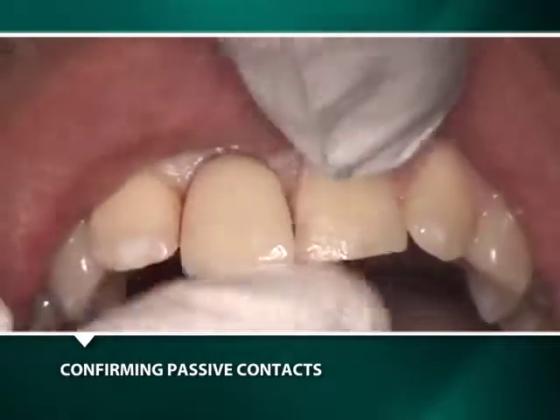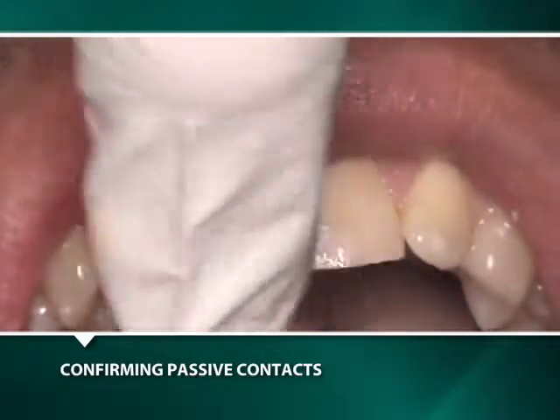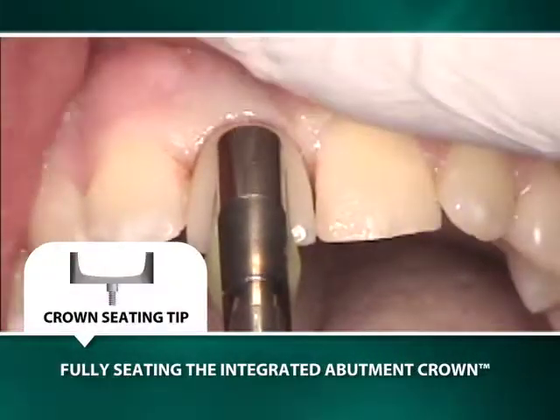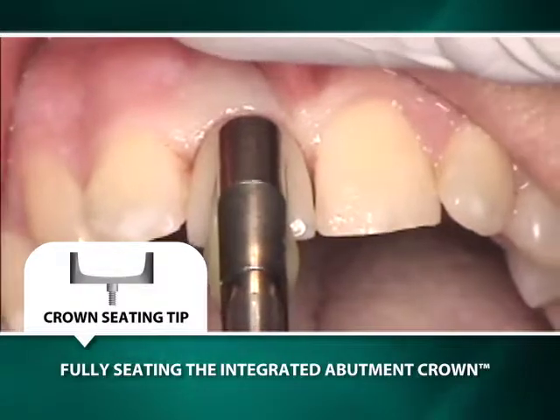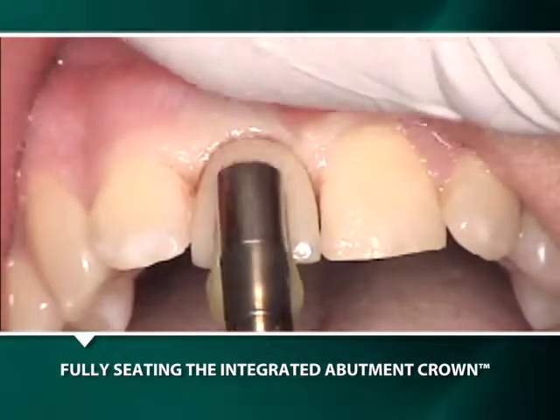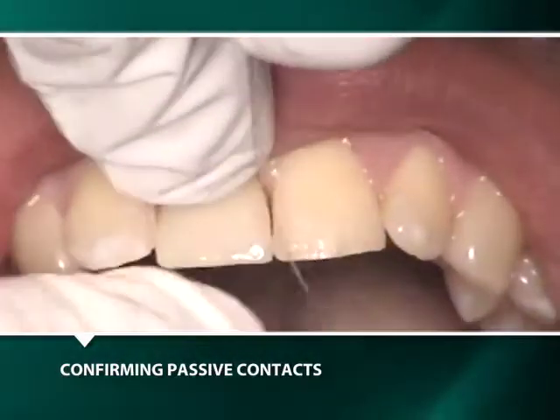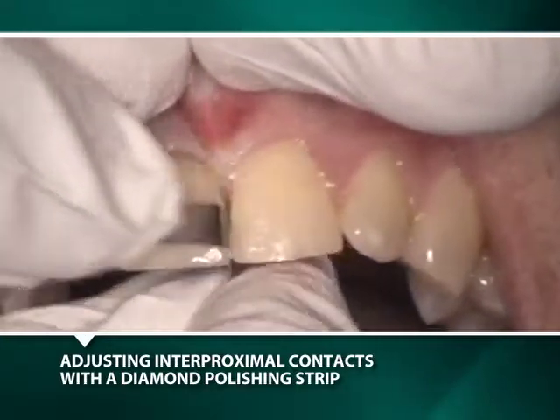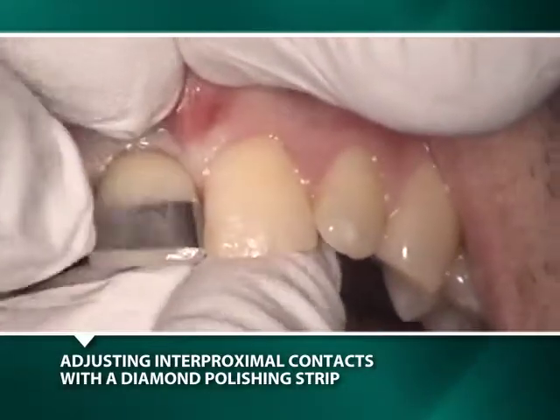After confirmation of passive interproximal contacts, the IAC is definitively seated with a couple of gentle taps using a yellow thermoplastic custom seating sheet, which was formed with a crown alignment device seated in a crown seating tip attached to a straight handle to facilitate directing the tapping forces in the long axis of the abutment post and well.